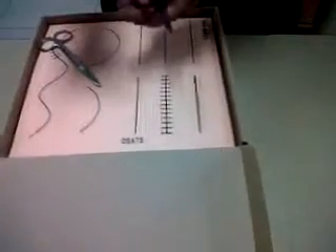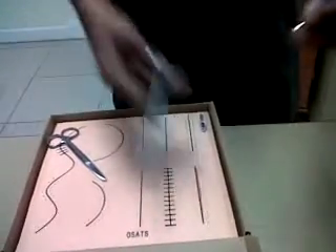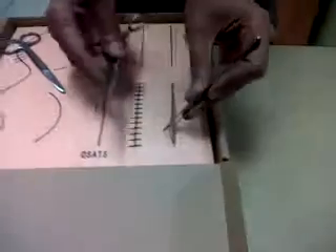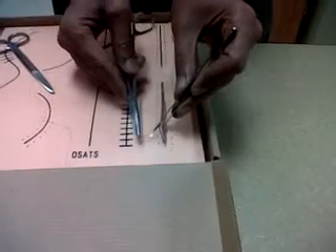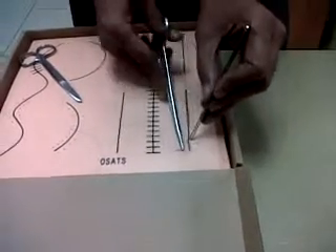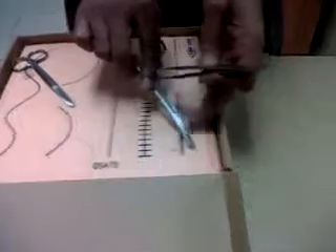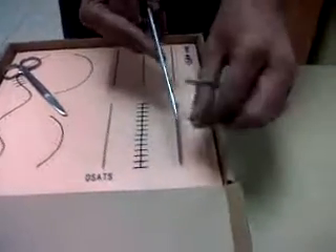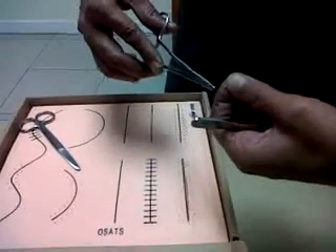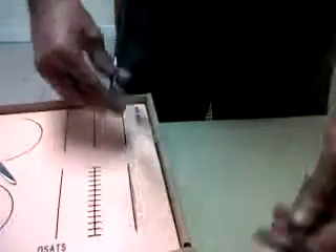For these two reasons we should not cut it too close to the knot. So that was a simple stitch. Now let's demonstrate the vertical mattress. The first step is pretty much the same — hold it the way demonstrated, take a full thickness bite, full thickness bite without taking it out, push and pull it out with the curving motion. Next, hold it close to the tip.